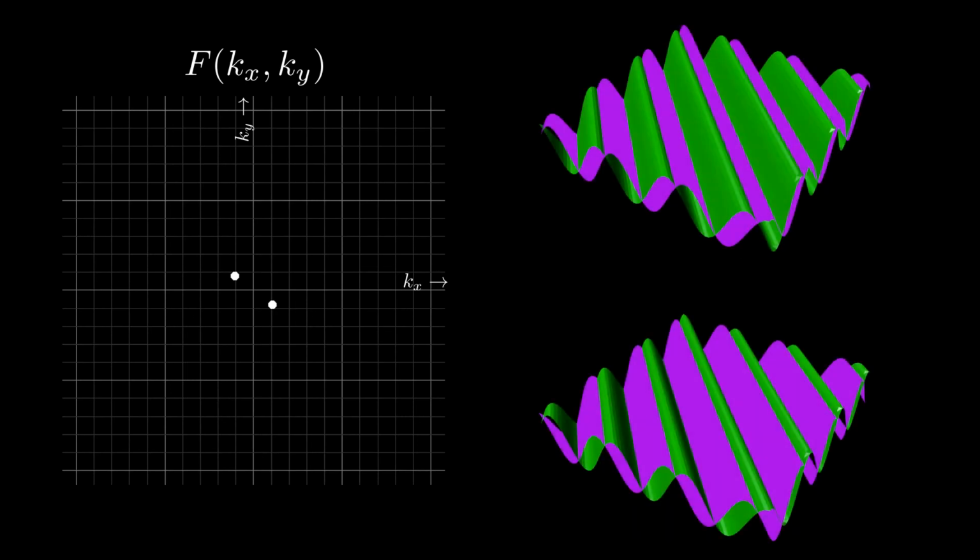So wait, is it possible to tell these spatial frequencies apart in an image? And if not, does that mean that k-space is redundant? The same information appears twice? Well, remember, the images I'm showing on the right here are the real parts of the sinusoids, which are in fact complex. There is an imaginary part too. Here are the two sinusoids of reversed frequencies showing both real and imaginary parts, in green and purple respectively. The top sinusoid progresses in this direction since real leads imaginary in this way, and vice versa for the bottom.